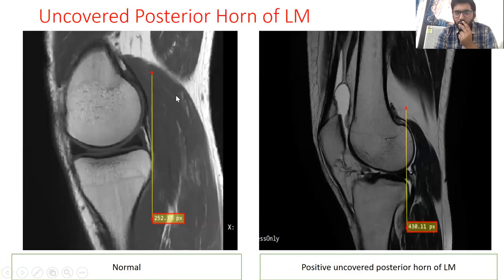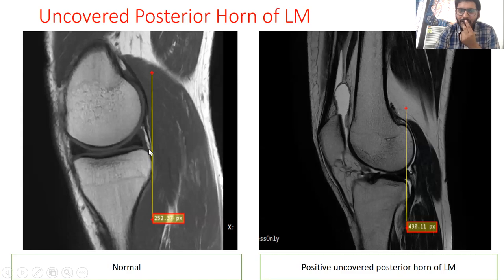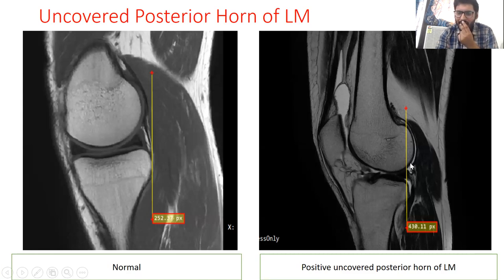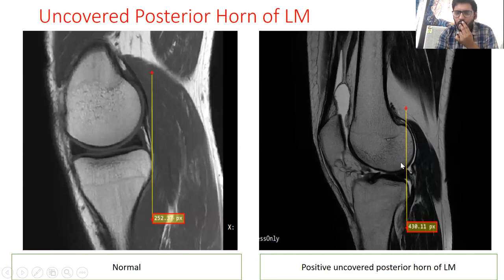The posterior horn of the lateral meniscus is not attached to the lateral collateral ligament and is inherently more mobile than the posterior horn of the medial meniscus. The uncovered posterior horn of lateral meniscus sign is said to be positive if a tangent line drawn along the posterior margin of the tibia intersects the posterior horn of the lateral meniscus.